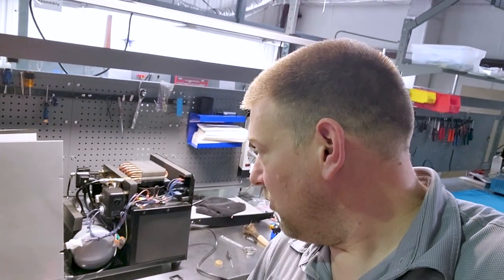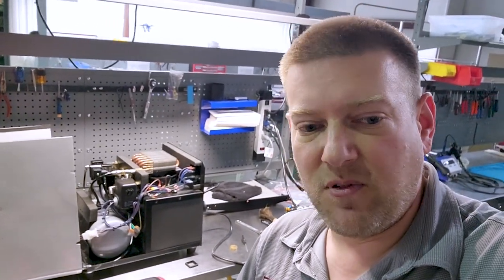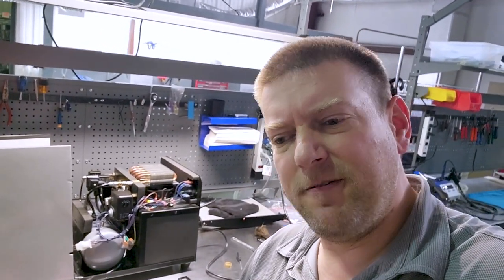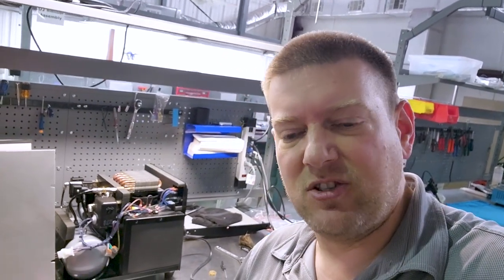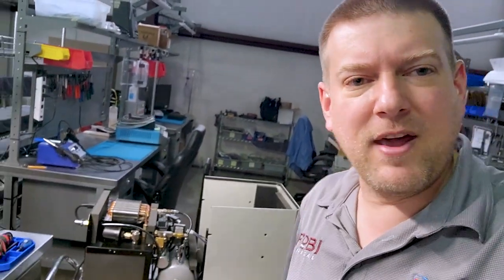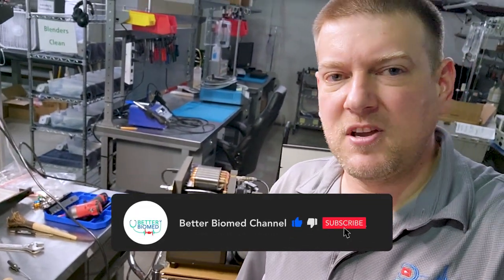It's a pretty reliable little air compressor, and you find them all throughout physical therapy spaces and other medical areas like laboratories. But it's just one of those things. I've never seen a solenoid fail like that before, where it arcs through the insulation to ground. Kind of crazy, but it does exist. So anyway, guys, that is the Jun-Air. I've got a couple of them here. I'm going to service them, get them back up and going, and make these customers happy.